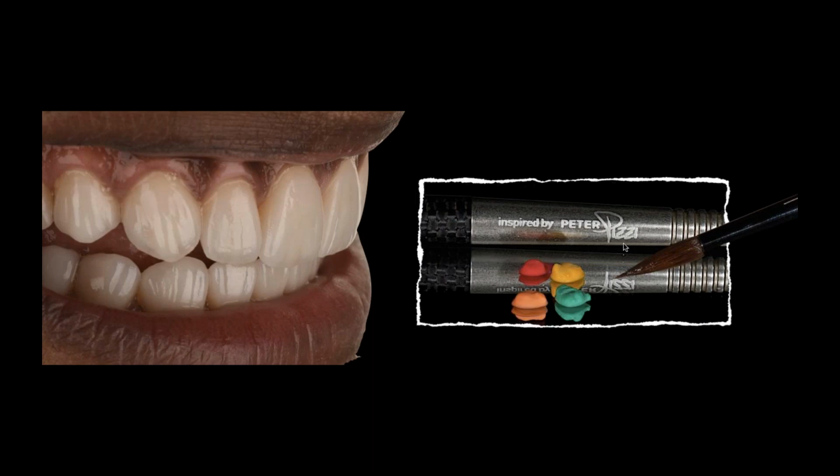Because optically the material is a little different, because it's either thicker or rounded or curved. So when we're talking about a halo, for me to create a halo, I'm usually using a combination of a dentin, a translucent dentin mixed with enamel. It's usually brighter and whiter. So if I'm building a 1M1, I might be using OM2 or even OM1 mixed with an enamel because I want to really create an opacified surface.